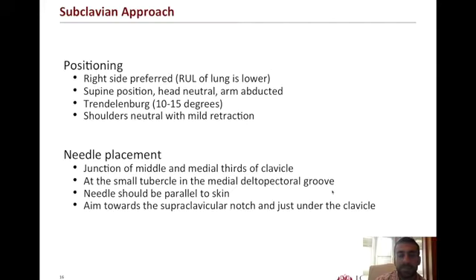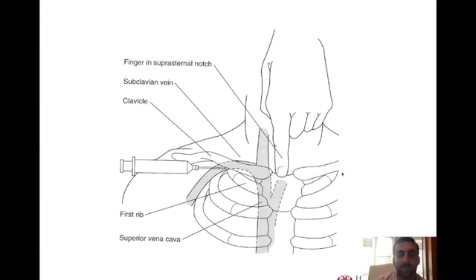This again is the standard procedure for non-ultrasound guided subclavian vein approach. And so we'll first talk about how ultrasound can be added to the standard traditional approach, and I'll show you that here. So there's a cartoon showing the initial placement. We see the subclavian vein diving under the clavicle here, forming that nice routine pathway that we rely on regularly to cannulate the subclavian vein.